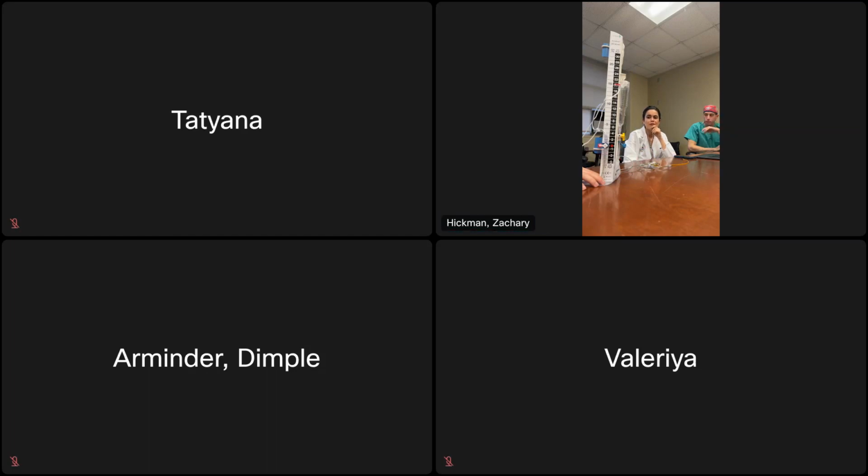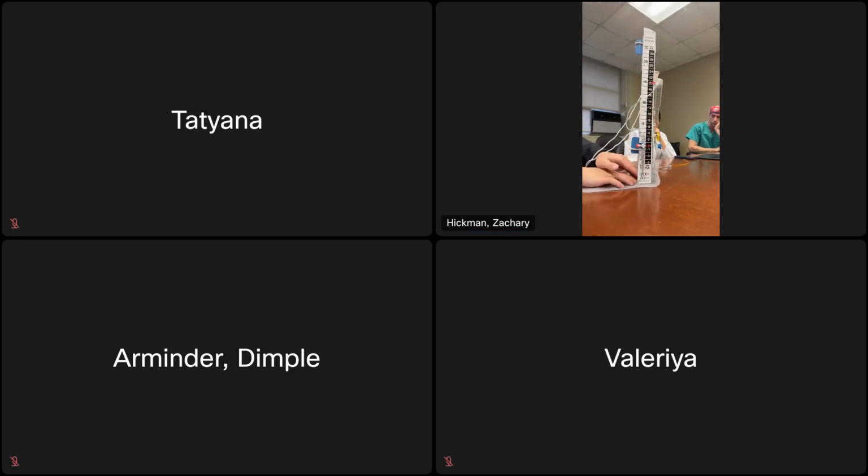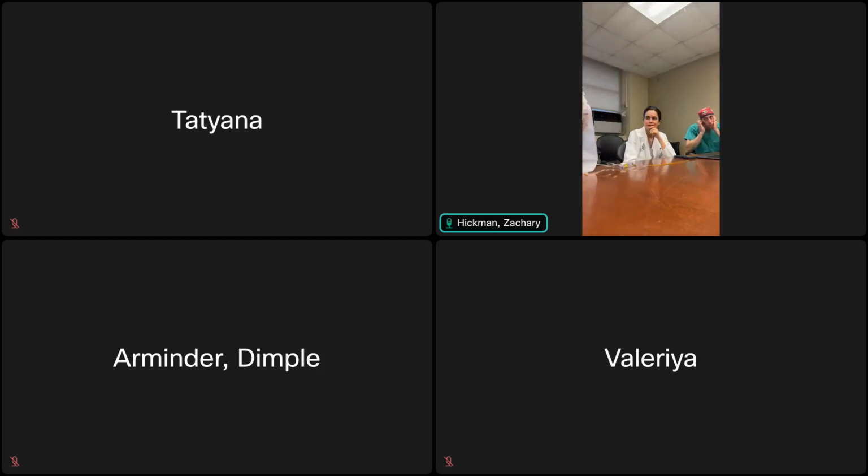Okay. So yeah, how do you zero the drain? Positioning is important. You want the bottom of this to be lined up with the patient's tragus. So the zero line here is basically you want it with the patient's tragus here. And then something you'll notice is, as you've set this all up nicely and got it leveled, someone just goes and presses the bed and moves the head.